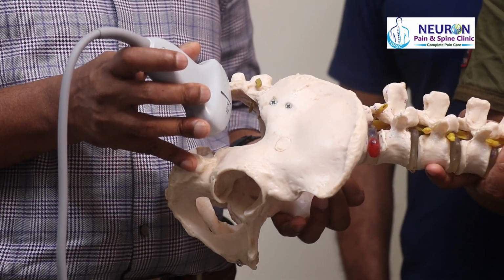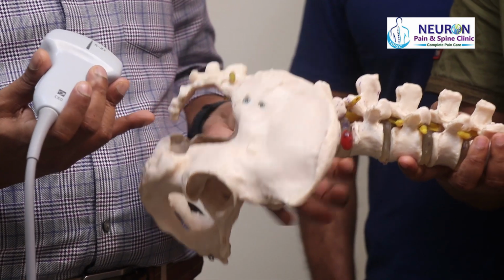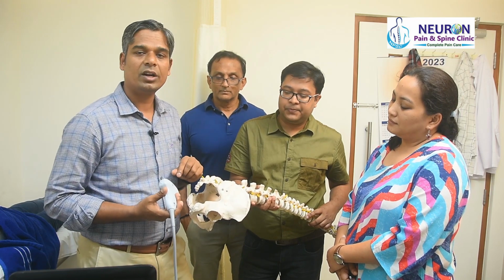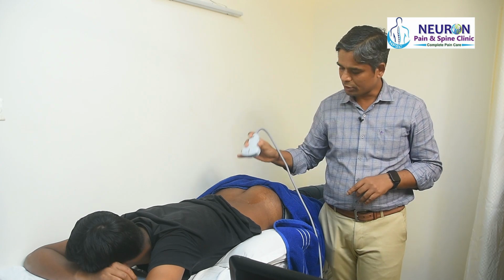And in this second little oblique scanning, as I scan a little down, I will see this ischial tuberosity, the obturator internus, and I can scan down further for that quadratus femoris muscle. So I am using a low frequency curvilinear probe.